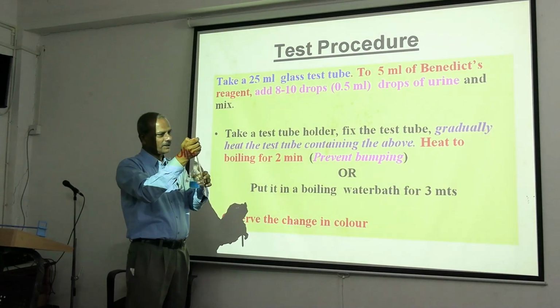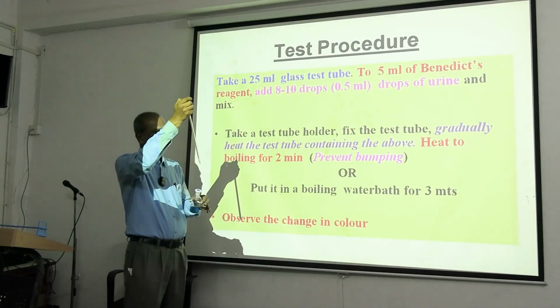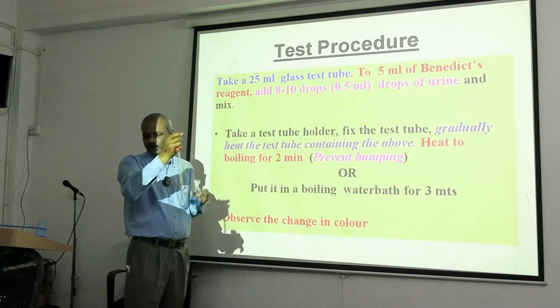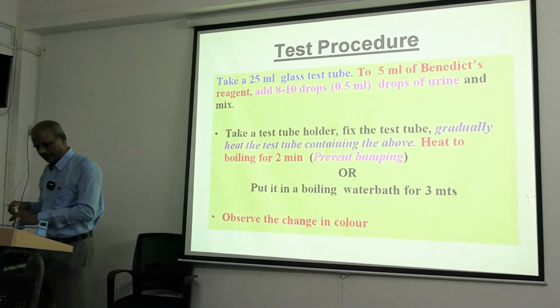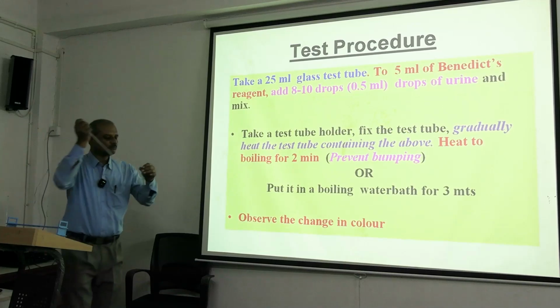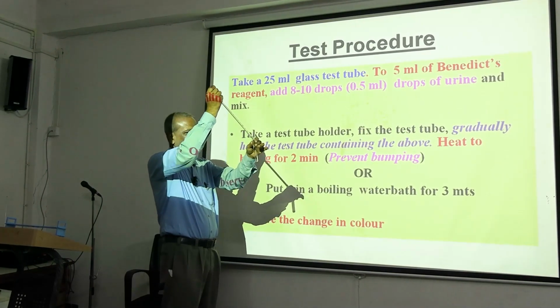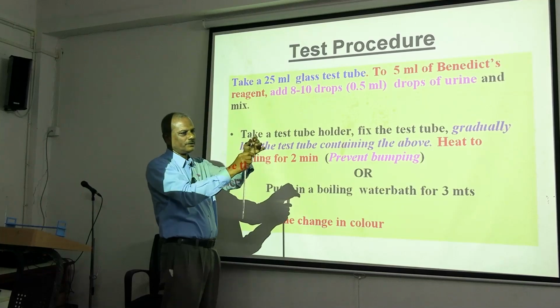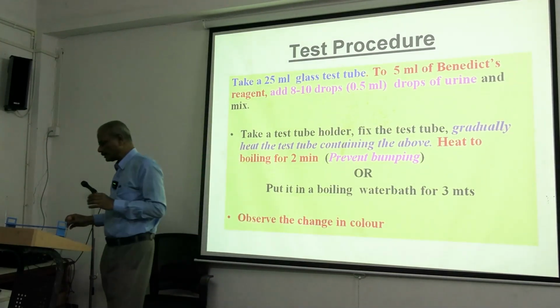If air enters, then you will not get the volume, and again you have to suck to the desired volume up to 5 ml. Once you draw up to 5 ml, dispense it in the test tube. So 5 ml will be dispensed, and leave it or give it to your friends so that they can test it.